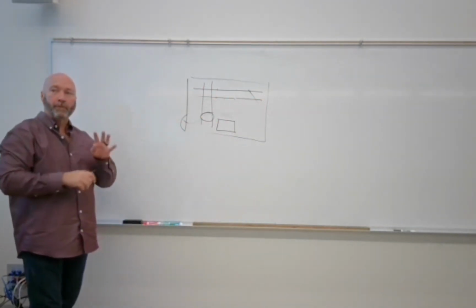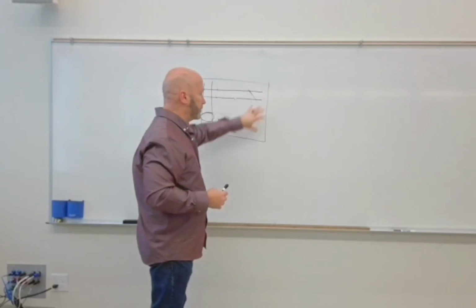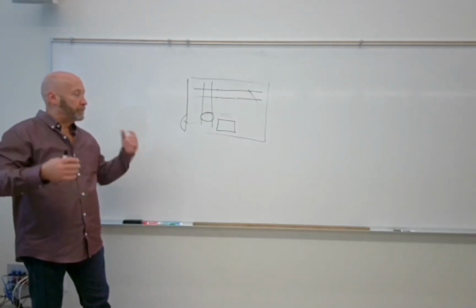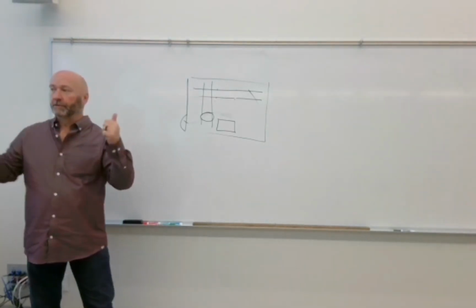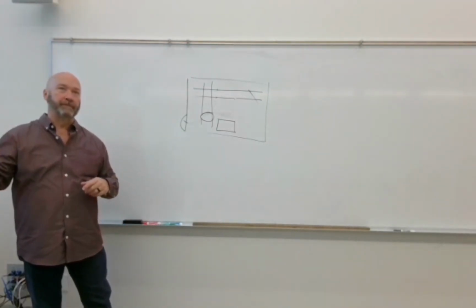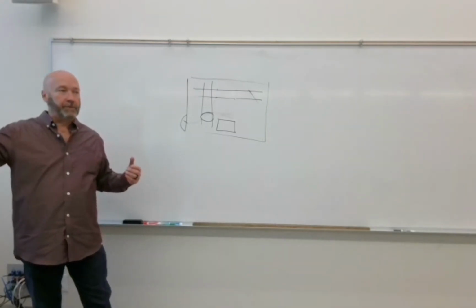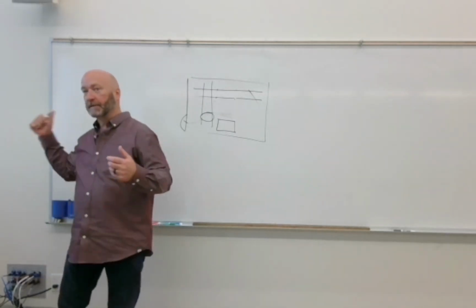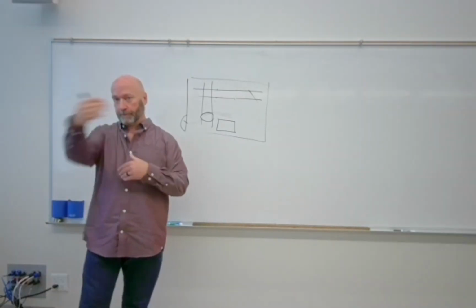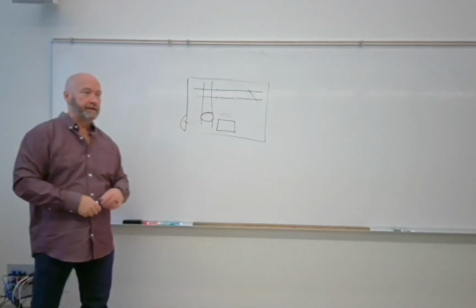And in those 4 rails, 2 sets of rails mounted perpendicular to each other, you can move that control tower anywhere in the room. Very flexible. It also gives you the ability to take the X-ray tube and swivel in any direction. You point that X-ray tube in any direction, so that if you were doing, let's say, a surgical lateral hip, you wheel the patient in foot first. You could get on this side of the X-ray table and shoot a left surgical lateral hip, right? Or you can put the X-ray tube on the opposite side and shoot a right surgical lateral hip. You could shoot anything that you wanted to in that X-ray room.